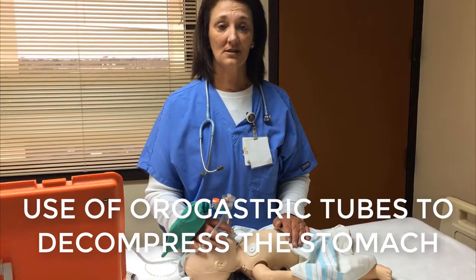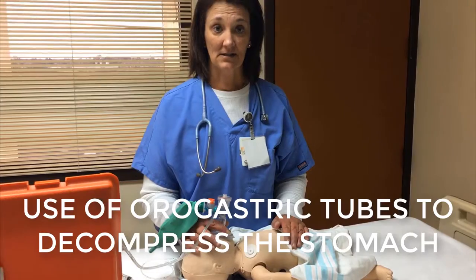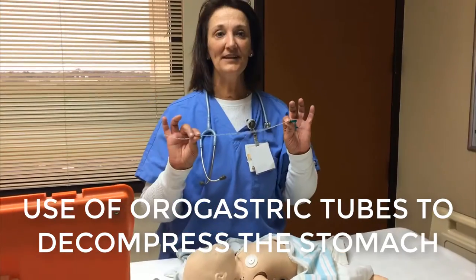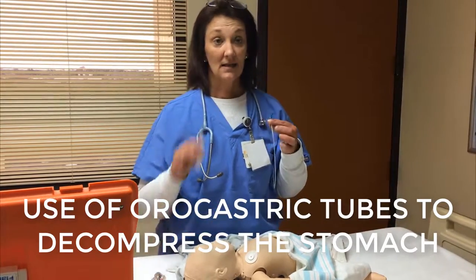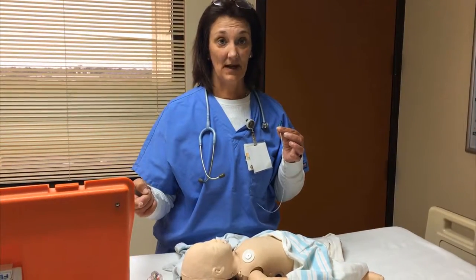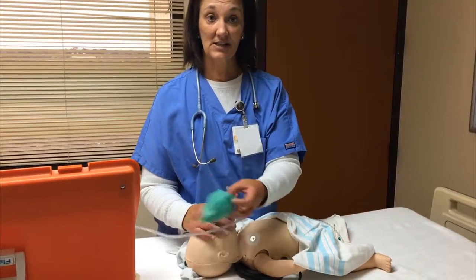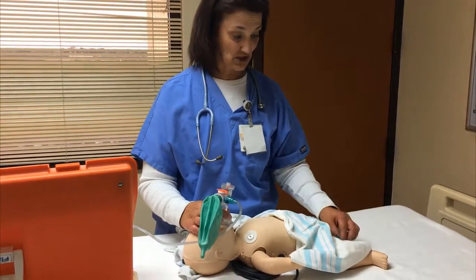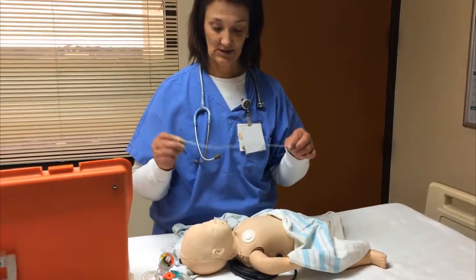So while administering either positive pressure ventilation or CPAP, air may get trapped in the baby's stomach. We need to get an 8 French orogastric tube, a syringe, and I have some tape handy here. So what we're going to do is, while the positive pressure ventilation or CPAP is going on, you can actually measure it with the mask on. But I'm going to go ahead and show you what the measurement looks like.